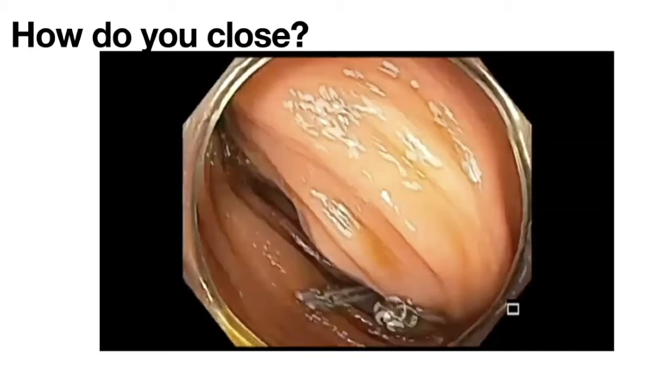And the other thing that I notice is when I do the chromo, once I inject and then try to look for things, for some reason, every time I inject and then a puddle comes down and I have to suck, by doing that, the colon tends to go into spasms. And this is what I see in practice. So I wanted to hear what others would do. Sylvia, how do you normally do your high-risk case examination?